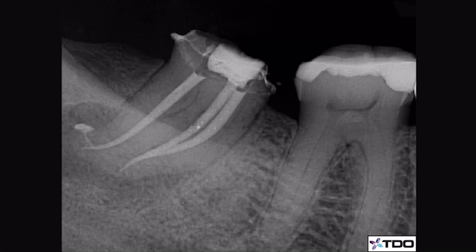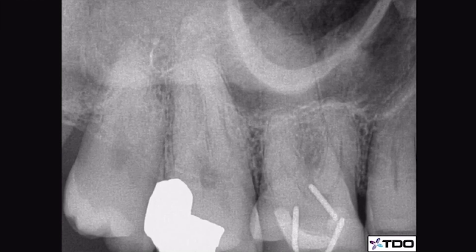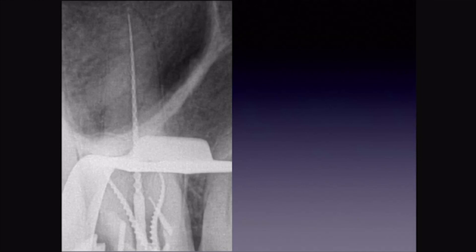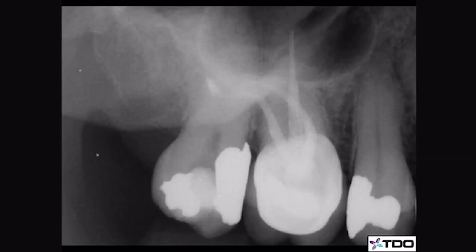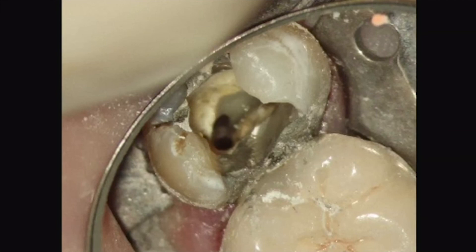GuttaCore allows you to fill canals in directions you could never otherwise fill. This is my size verifier film confirming my measurement, and then I fill. You can see how nicely GuttaCore flows in places you could never get it to with single point or lateral techniques. This tooth had so many lateral canals addressed in the apical third of the palatal root — and look at this second molar, found to have not one buccal canal but two. We instrumented and filled, and look at that lateral canal on the palatal root near the apex. GuttaCore is an incredible material.